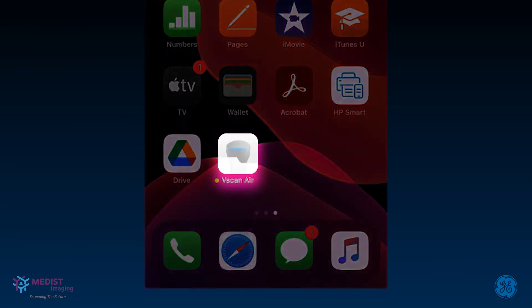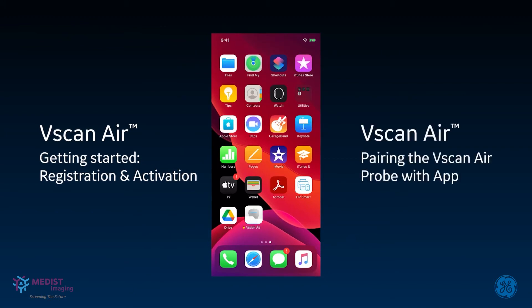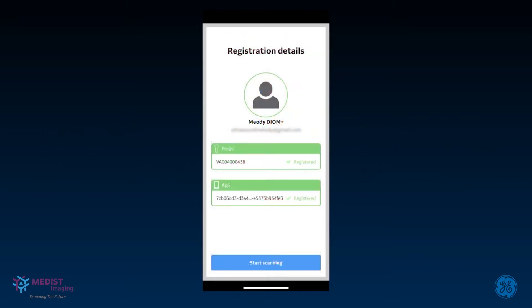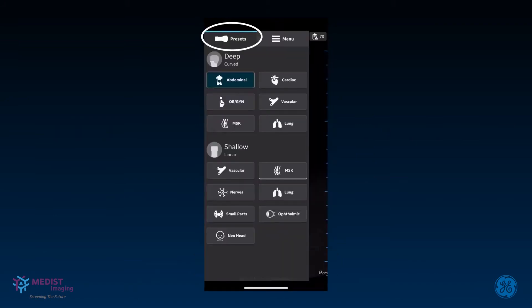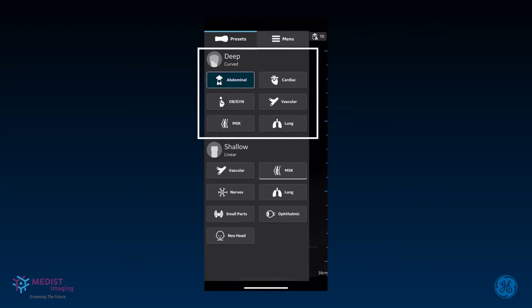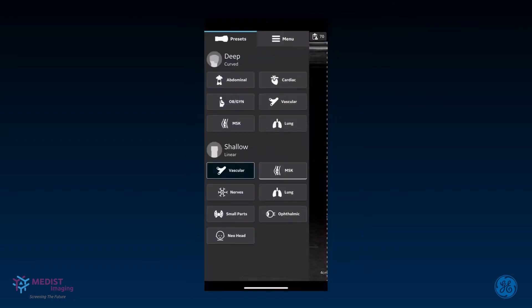Let's see how to start using your vScan Air app. Please watch the videos on registration, activation, and pairing to prepare your device prior to scanning. Once the probe is successfully connected with the app, you're ready to scan. The Presets panel opens with the default preset loaded. Presets are grouped according to the transducers — deep scanning presets under the curved array, and shallow scanning under the linear array. The transducer is switched automatically based on the selected preset. Any preset can be set as the default by pressing and holding on it, readily identified by a white bar below the button.